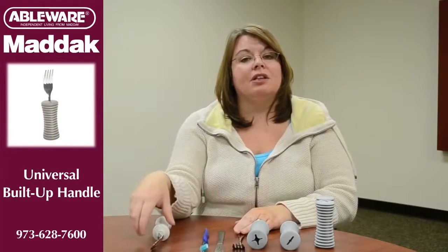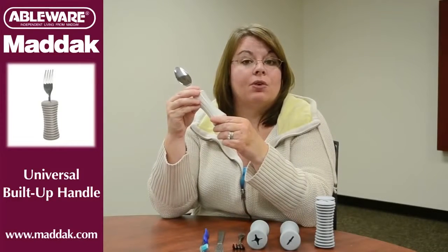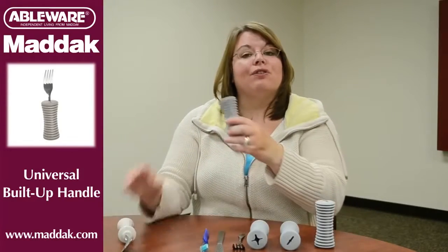There are utensils on the market that have built-up handles. The larger diameter makes them easier to hold and reduces pain. And while this solution works, Maddak has a better solution: the universal built-up handle.